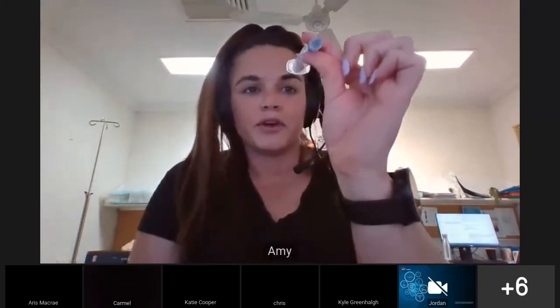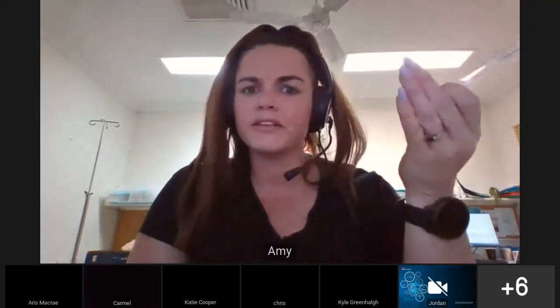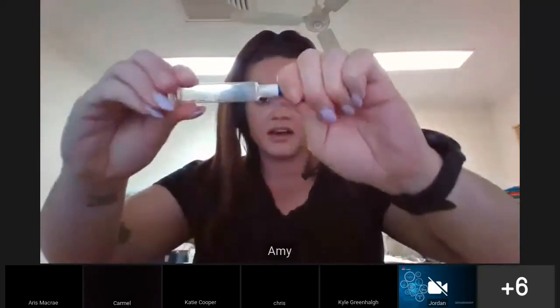If you pop that on and for whatever reason you cannot see through, or it's partially obstructed, then you might have an issue. One of the reasons that we often find a partial obstruction when you're looking through there is that sometimes we just accidentally don't screw our syringes onto our bungs properly, and that's relevant in point of care as well. So that could cause hemolysis.